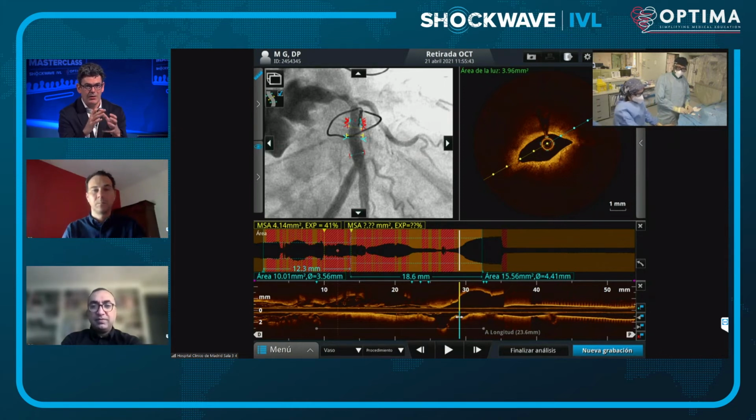And so I think, Javier, rather than just delivering 10 shocks here, so one pulse sequence, we will be delivering all of the shocks. Javier, can you comment? You've done quite a lot of left main cases now. What's been your experience where there have been predominantly eccentric lesions? Is it effective? Yeah, it's a very good point.